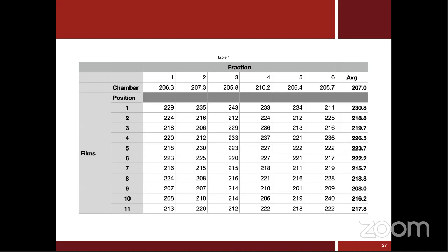If you wear gloves, try not to contaminate your film. But if it got contaminated after you expose them, that would be an issue, especially if this was done on the patient. That would be a problem. So you have to be a bit careful about how you handle films. I really don't know what sort of material to use. I usually would just take a piece of tissue napkin and try to remove this grease from there.